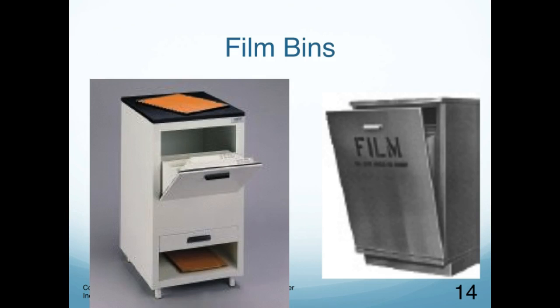So here's a film bin. This is what they look like. This is more along the lines of what I'm used to. They would basically have you 14 by 17. We had something called a 7 by 17, and we used to have 9 by 9s. Those are all gone now. You used to have 11 by 14s. I think most of you are used to your 8 by 10s, your 10 by 12s, and your 14 by 17s anymore. And then, of course, we have the Panorex film also.